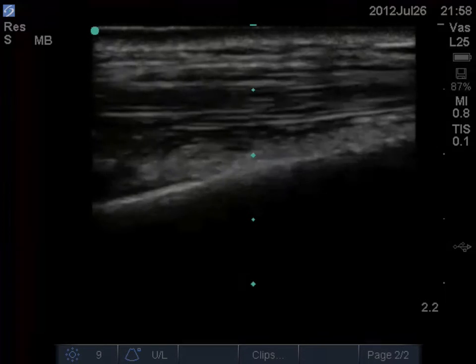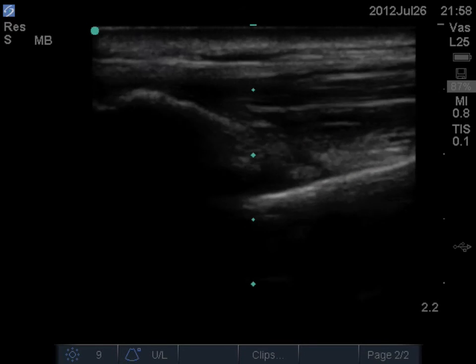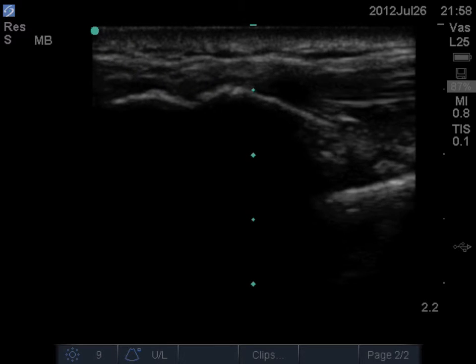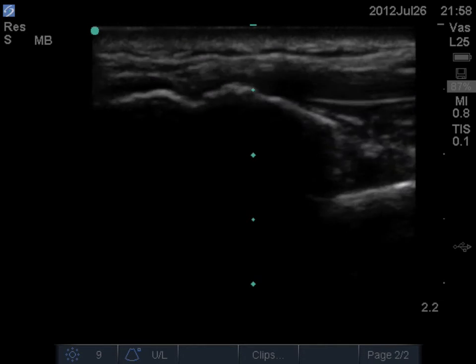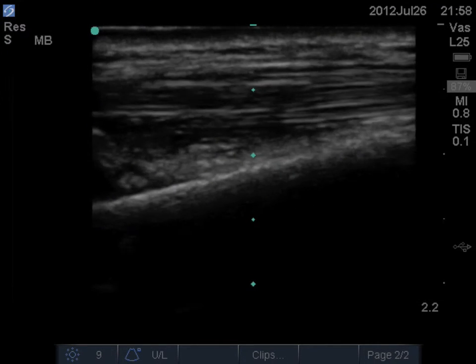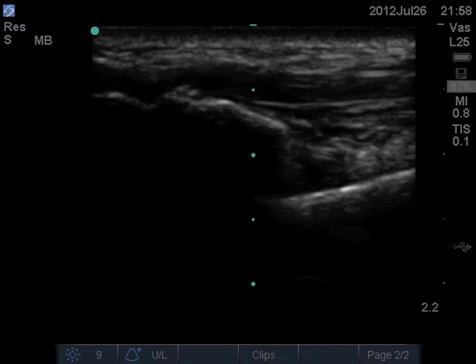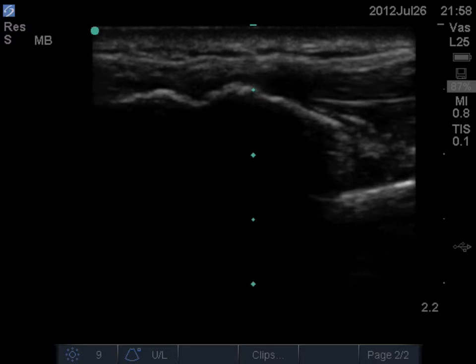Yes, there is. We can follow the smooth, bright line as the image moves to the left, when suddenly there is a step deformity. The bright line stops abruptly and restarts at a different depth. This is what a fracture looks like. In this case, this was a dorsally angulated Colles fracture.